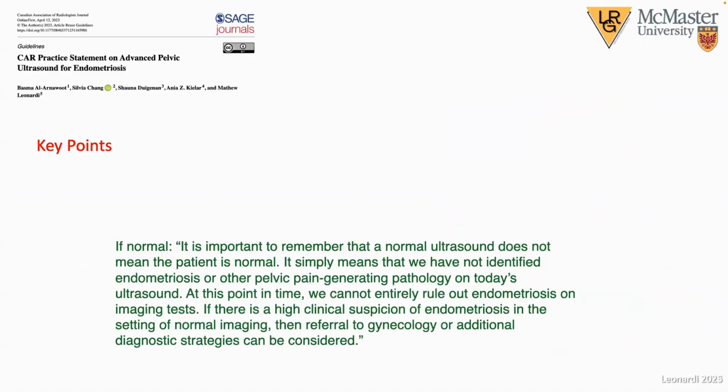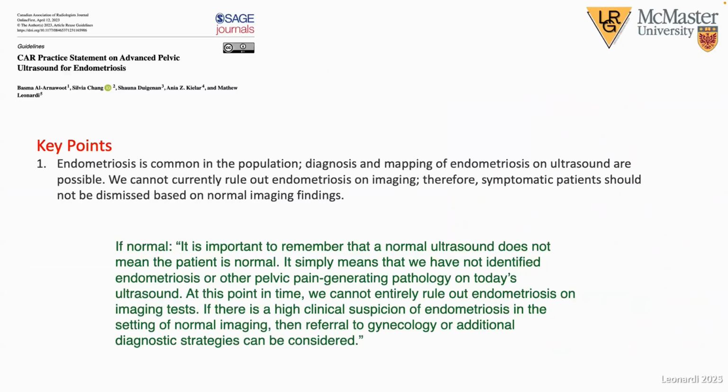So back to the CAR practice statement on advanced pelvic ultrasound. The first point that we made, and this was discussed already by Priscila, this is very common. Up to 10% of our patient population walking around the world, endometriosis is one of the most common diseases. And we can indeed diagnose and map the disease using ultrasound, but we cannot currently rule out endometriosis on any imaging modality. And that's in particular true for superficial endometriosis, the most mild subtype of the disease.